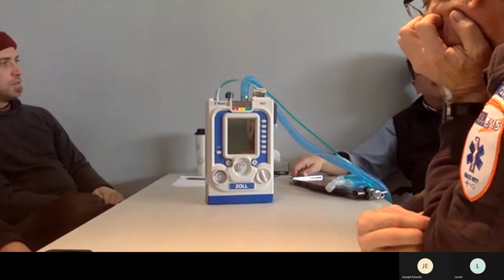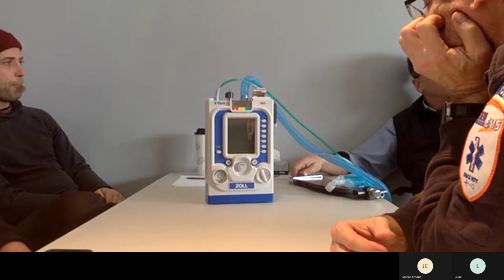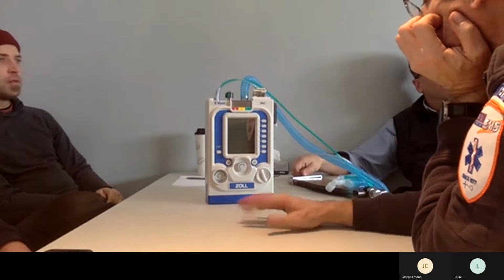What is SIMV at a rate of 0? That's CPAP, same thing. What's SIMV at a rate of 0 plus pressure support? BiPAP. Bi-level. Same thing.